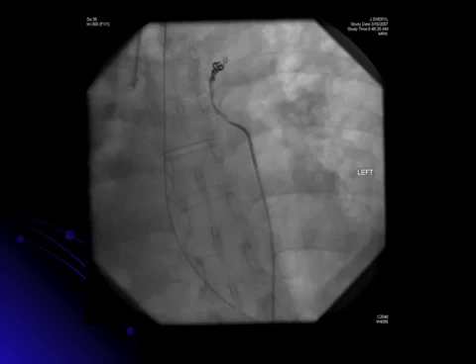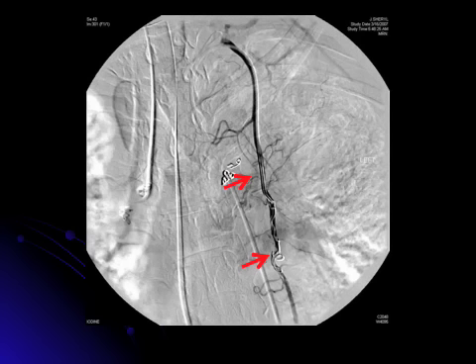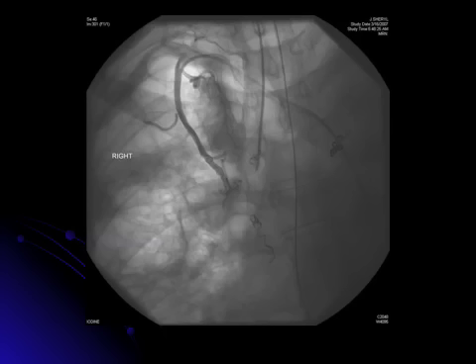At the completion of the initial study on all of these patients, after the bronchial arteries and intercostals are embolized, both internal mammaries are visualized and embolized if appropriate. Several coils were placed in the left internal mammary artery to prevent inadvertent embolization via collaterals down to the feet, and then small particles were placed. The same was then done on the right side.